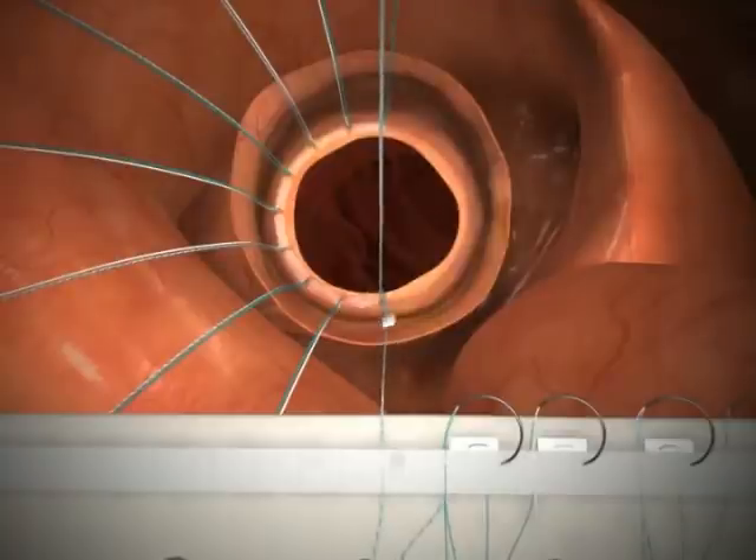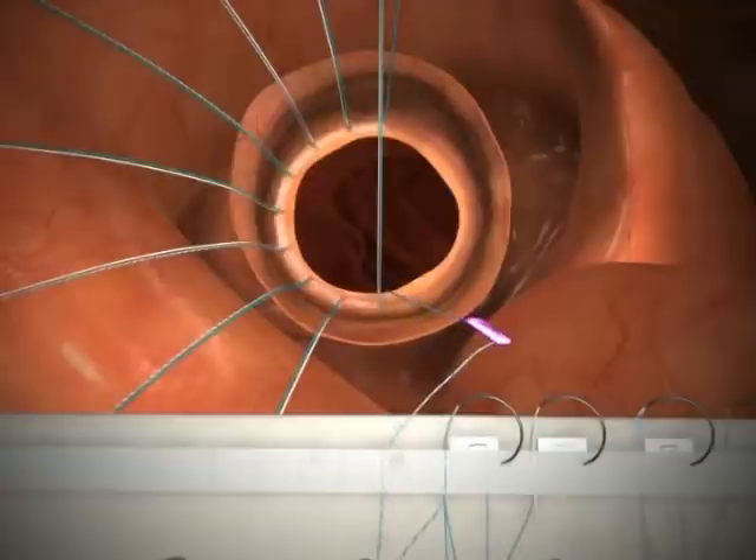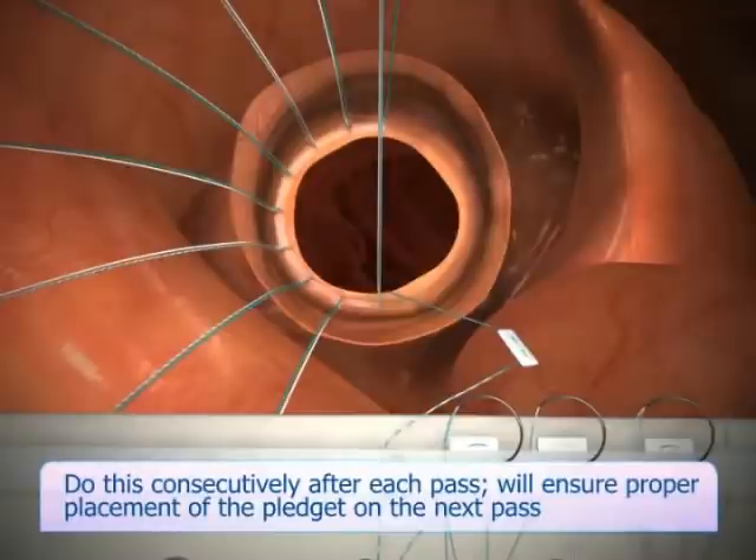If you are using pledgeted suture, push the pledget back halfway towards the Next Stitch pack starting with the passage of the second needle. Do this consecutively after each pass. This technique will ensure proper placement of the pledget on the next pass.